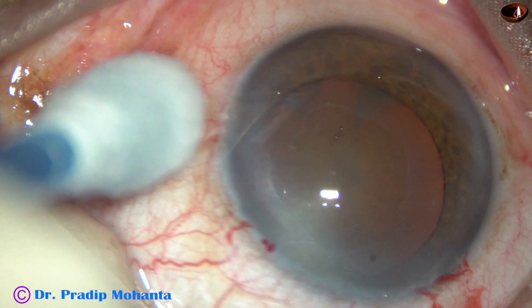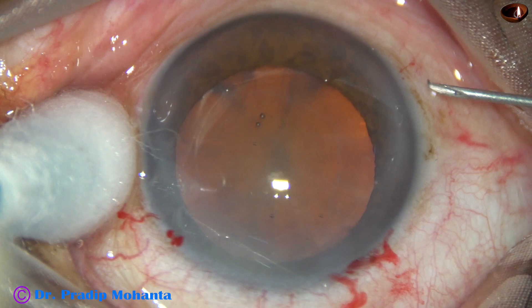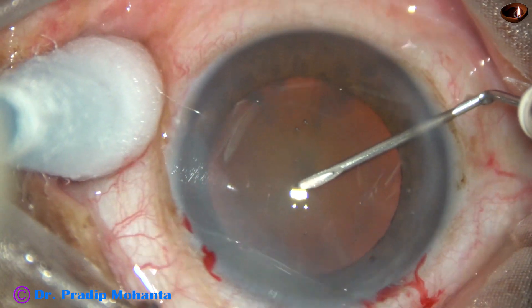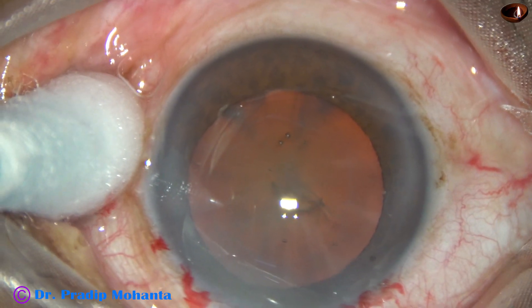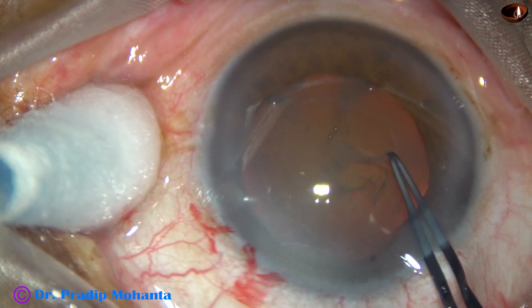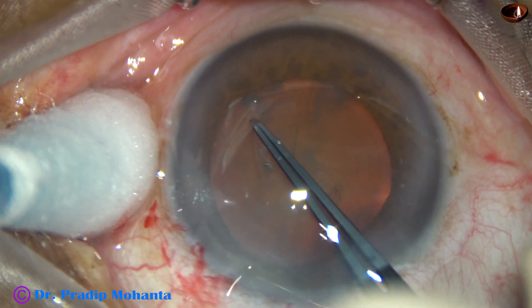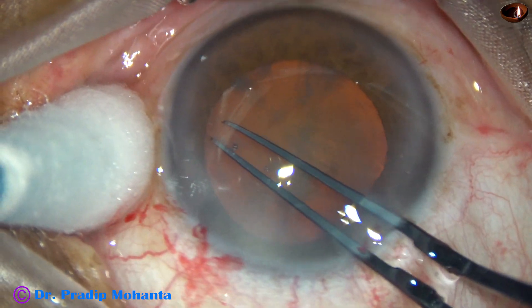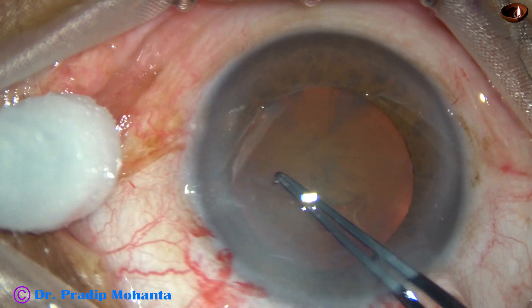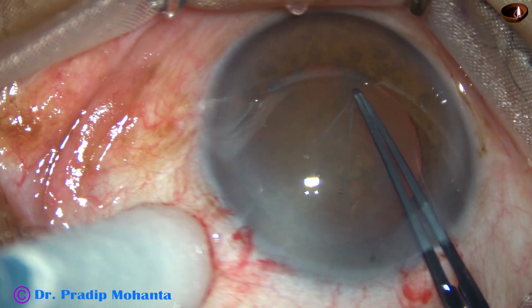And now, capsulorrhexis. The anterior capsule is being incised and the capsular tag is raised. I take a utrata forceps, hold this capsular tag, go anti-clockwise, and do the rhexis. In this case, at 3 o'clock, the capsule tended to go to the periphery. I apply this smart pull and retrieve the rhexis.